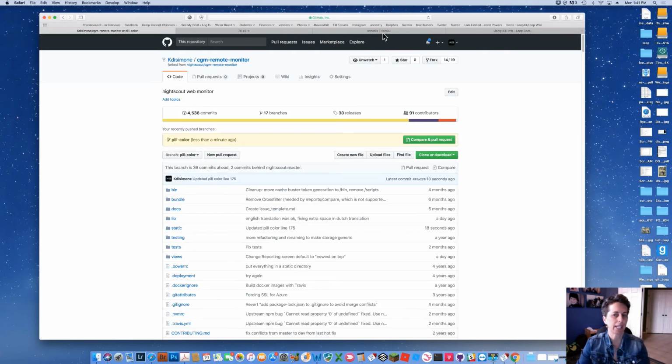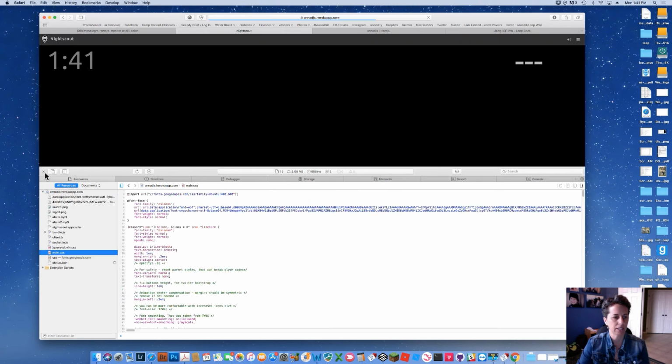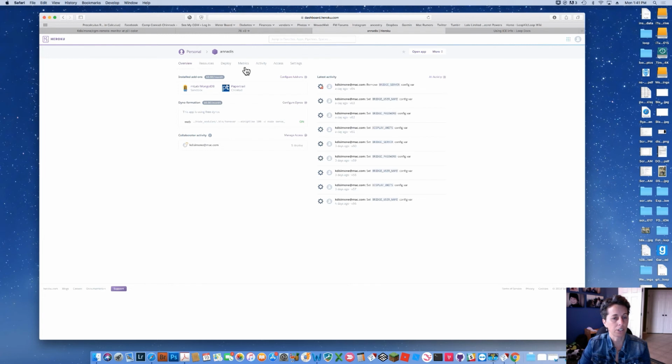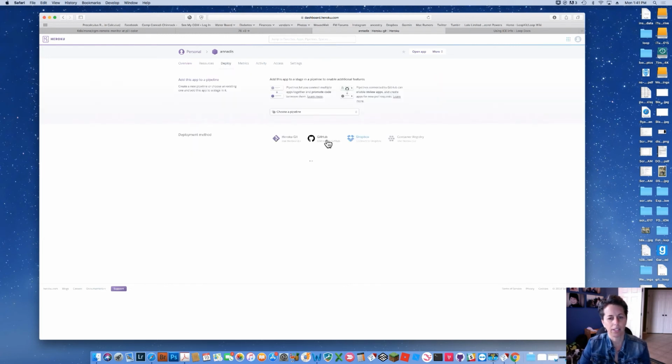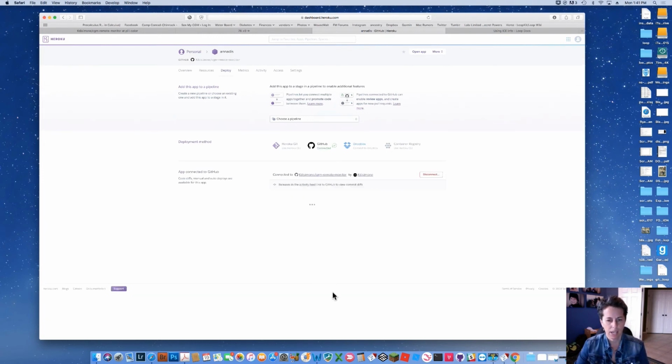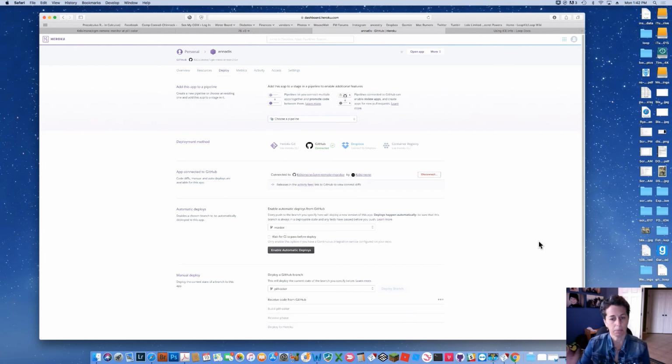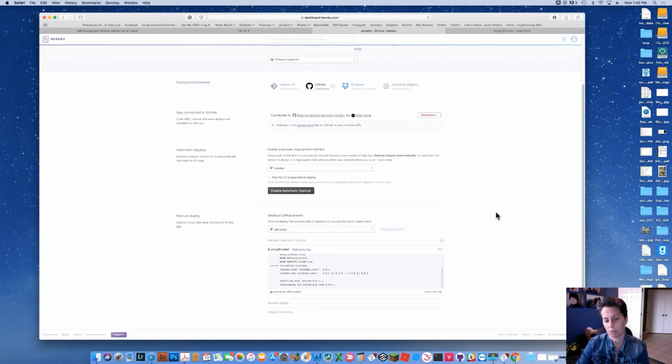And now how do I get this to my Nightscout site so that it actually will change? Because if I refresh this and close it, that was only a temporary change. That was just to visualize; that developer tool is just a temporary change. So I can go to Anna's Nightscout site, the Heroku control panel, and I go to deploy. And so long as I'm connected to my GitHub repo, I make sure I'm connected to it. And it will pull in all of the branches from my repo that are available to deploy from. And so what I will want to do is choose the pill color branch because that's the one I've decided I'd like my site to look like and to use that code. I deploy the branch and it's going to build for a little bit.